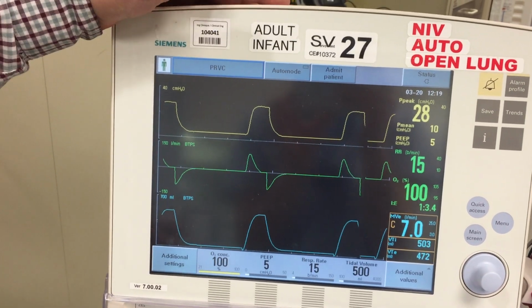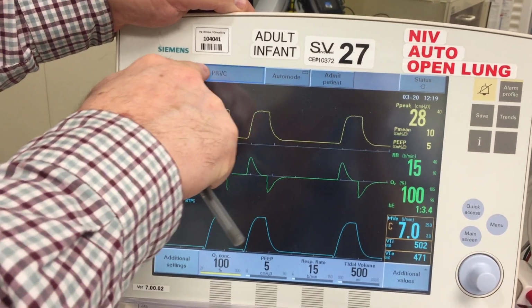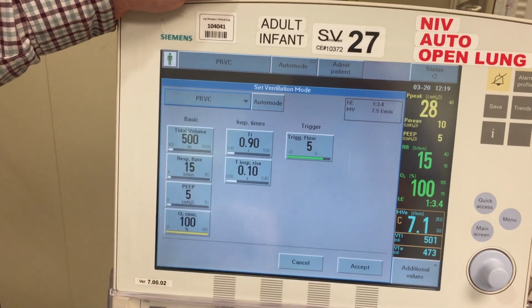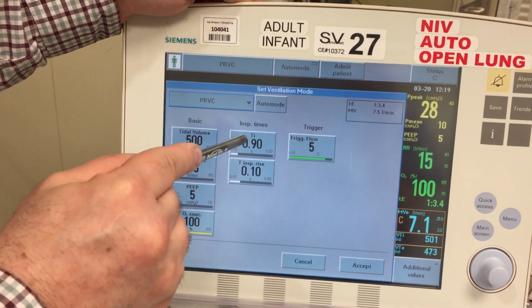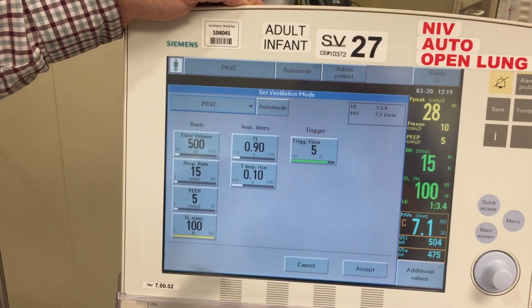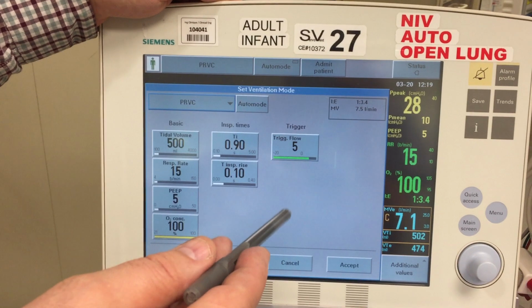With the flow waveform, this is how we would titrate our I time, and I'll get to what I time is. Inspiratory time is, if we click on our mode, which is up here, we notice there's a few other settings. We have our basic settings, which were down here, but we also have an inspiratory time. What we'll recommend is just go with 0.9 seconds, which is the default. And usually that's all you need.